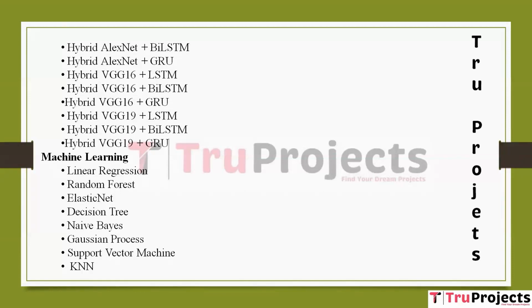Gaussian process. Gaussian process is a probabilistic model that can be used for regression and classification tasks. It models the distribution of data points as Gaussian distributions. In the context of sleep apnea detection, it can capture uncertainties and make probabilistic predictions. Support vector machine. SVM is a powerful classification algorithm that finds a hyperplane to separate different classes. It can be used for binary classification problems such as predicting the presence or absence of sleep apnea based on ECG features.